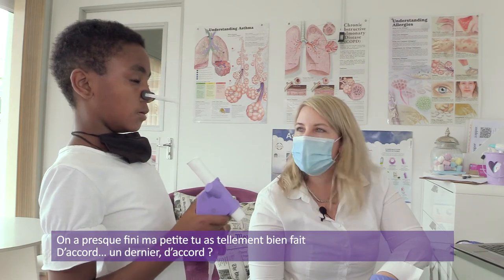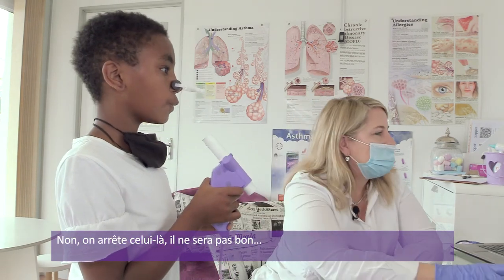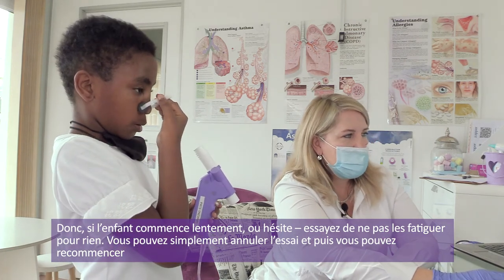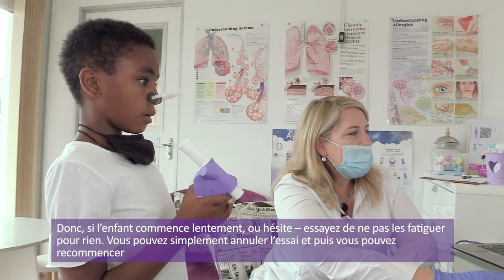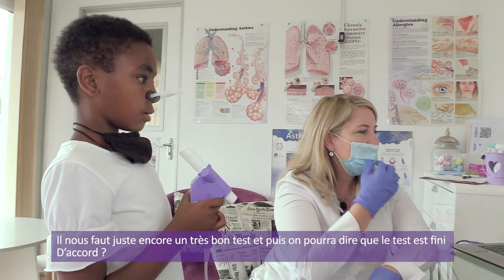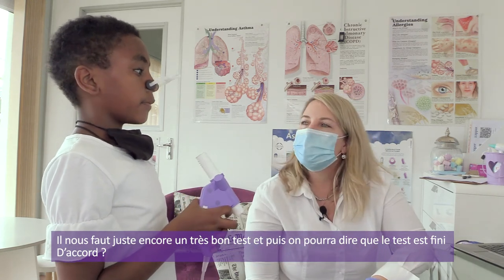Okay. Last one, hey? Okay, fast as you can. And go, go, go. Okay, wait. That one wasn't good. Let's just stop that one. So if the child has a slow start or a hesitation, try not to waste their energy. You can always cancel that blow and then you can start again. All right, so that one wasn't a good one. We just need one more really good test and then we can call this test complete.